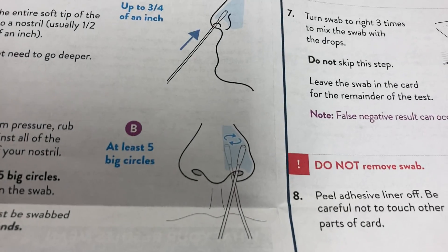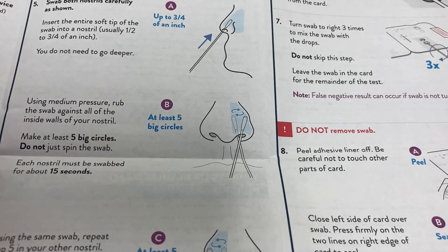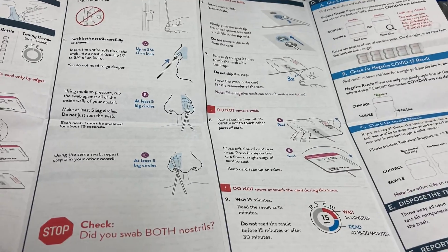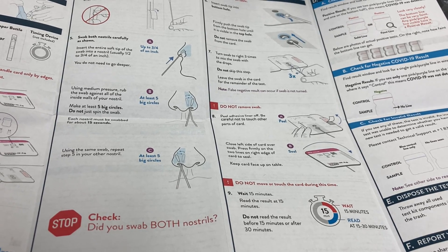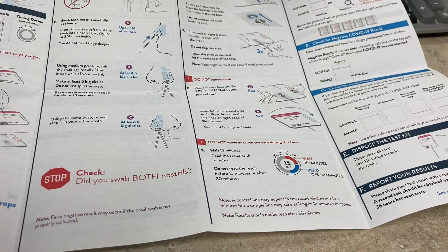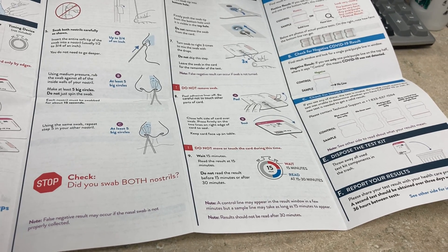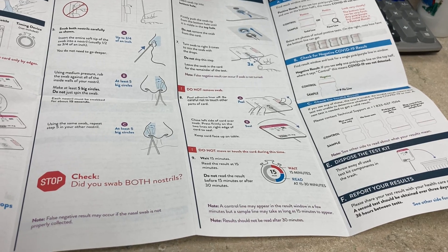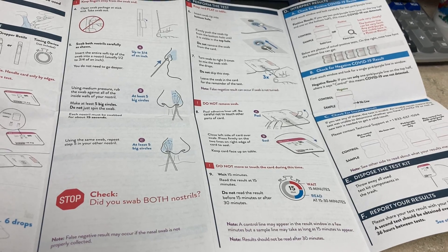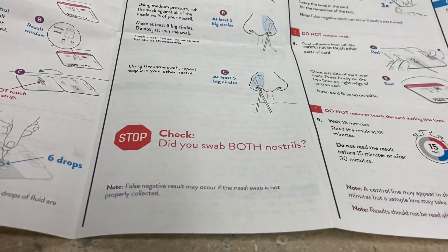After that, you take the swab and twirl it on both nostrils. Five big circles in each nostril — one, two, three, four, five, six on one side, and one, two, three, four, five, six on the other side.